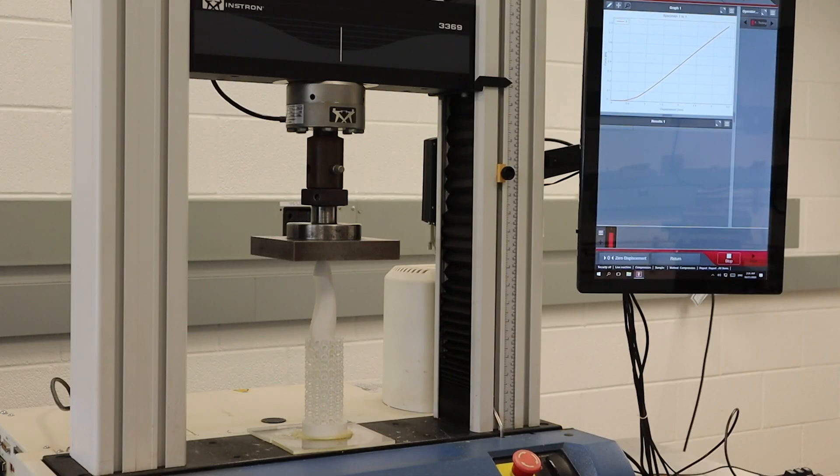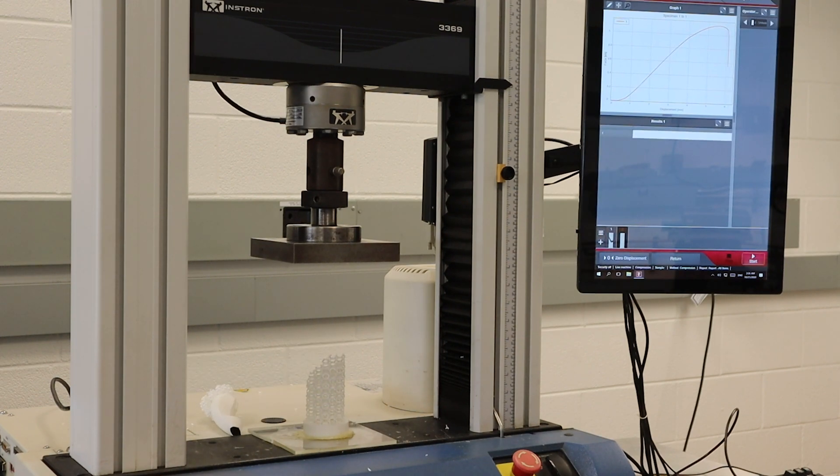Out of curiosity, I wanted to use UBC's hydraulic press to check the maximum weight of the 3D printed prosthetic. Here's a time lapse of Jaehyun Ann's prosthetic prototype. Interesting how the prosthetic fractured at a 45-degree angle.